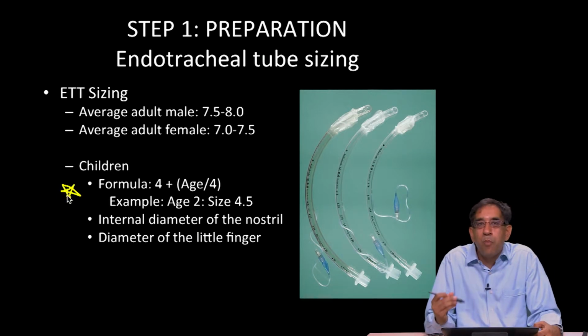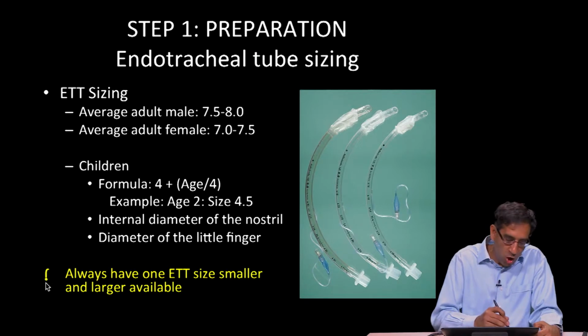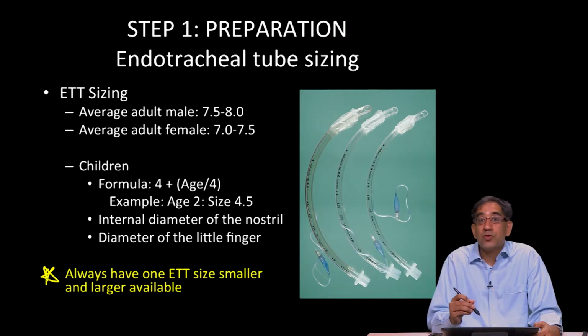A very important thing to remember is, no matter what you determine to be the size that you want to have ready, always get one size smaller and larger. Have it available. You never know until you get down there and find out that the actual cords are tighter than you thought. And if you have that endotracheal tube one size smaller ready, it's going to be easy to have it available and insert it rather than trying to find it at that time in that moment of crisis.